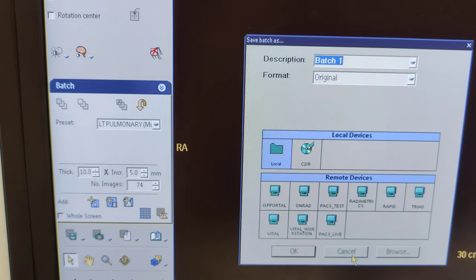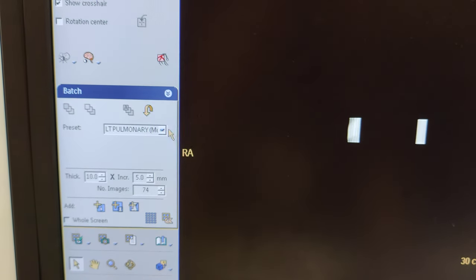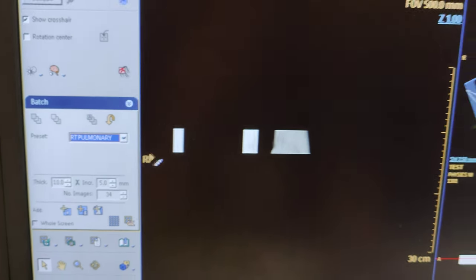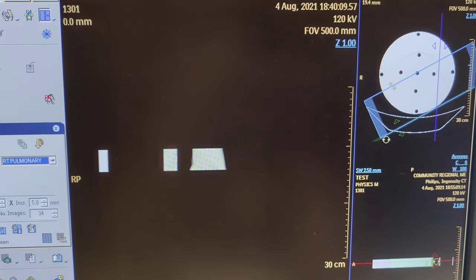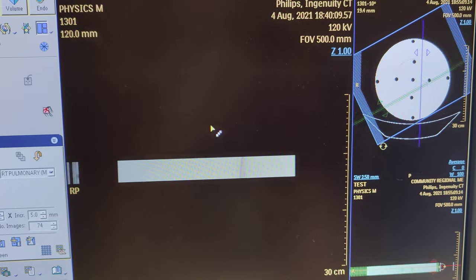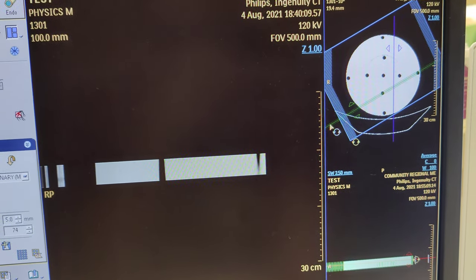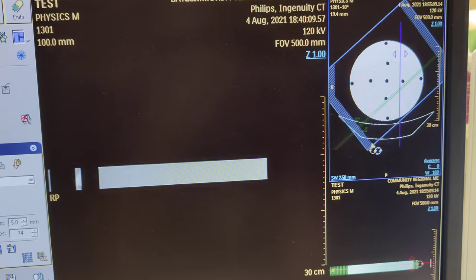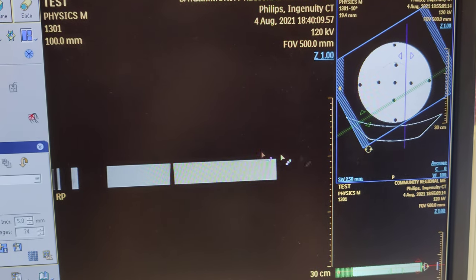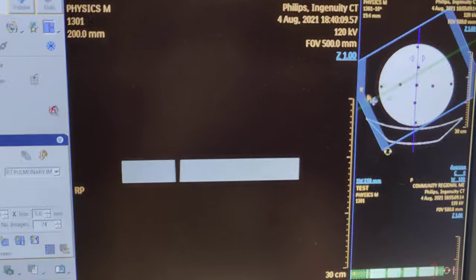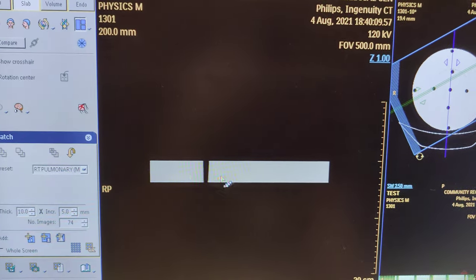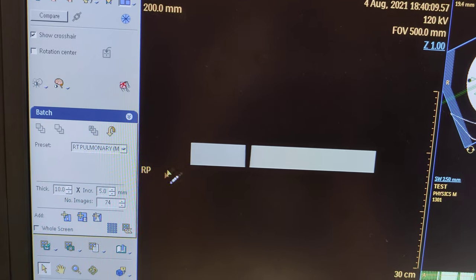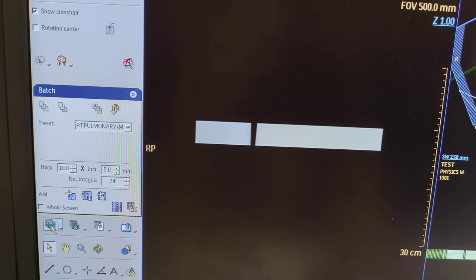That would be your left side. After that, you would do the same thing but for your right side. Again, you would straighten it up, make sure you go through it, and if it's not straight enough, you can rotate it so that it matches the right pulmonary. This is going to help you look through the pulmonary. Make sure it's nice and elongated, then save it again. Click this, label it, and save it.